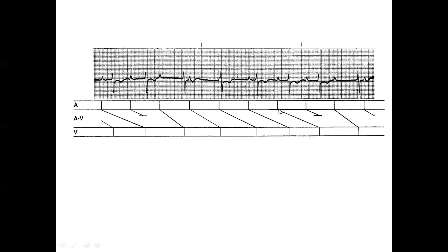And that's what we are seeing. So this P is not conducted to this one. Yes, this impulse is going down this way. While it is on its way to the terminal station, the impulse can begin here, now going to the ventricle. And it's this P that's blocked.